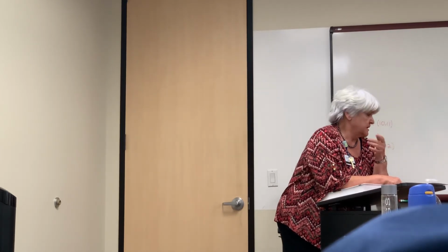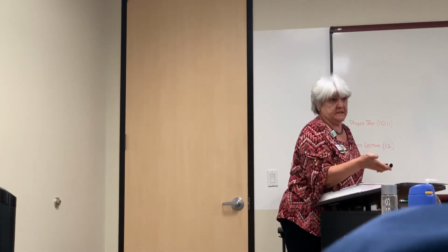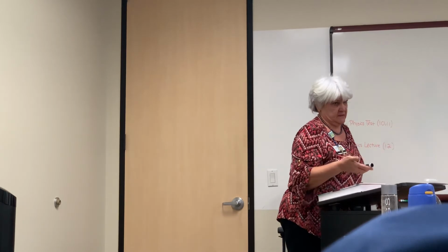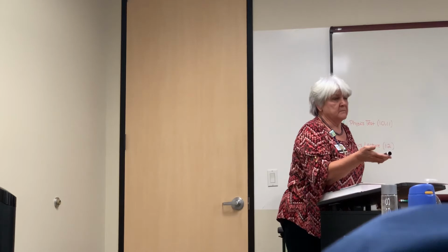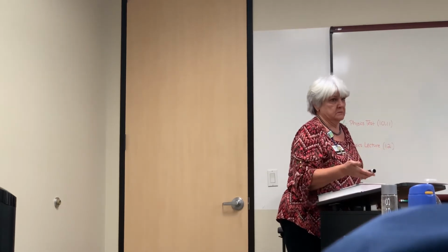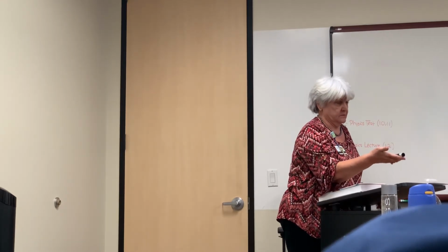I usually say, if I put the transducer in and they go, ow, ow, that hurts, I ask, does sex hurt also? If no, I'm going to finish my exam. Because if sex doesn't hurt, I'm not going to hurt her. I'm holding the transducer like this. I'm not even pushing in, I'm guiding myself in. If it's going to hurt, my hand wouldn't be able to maneuver.